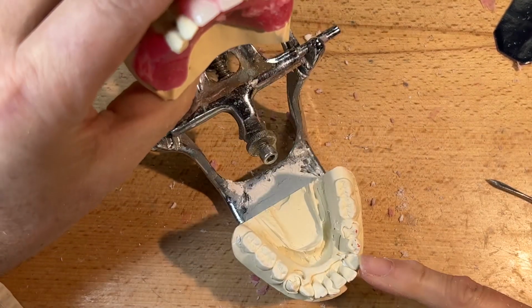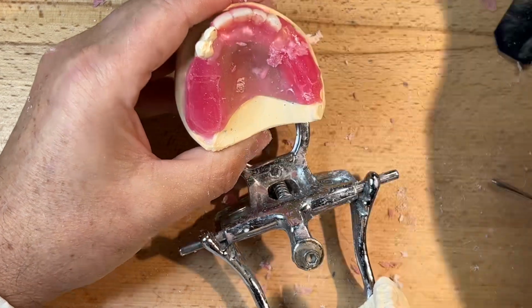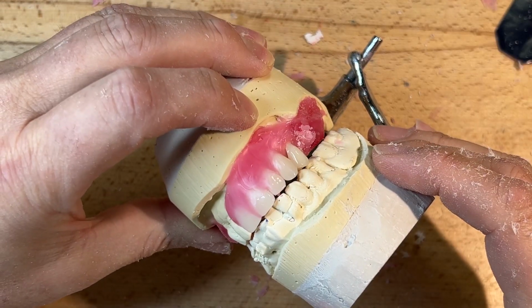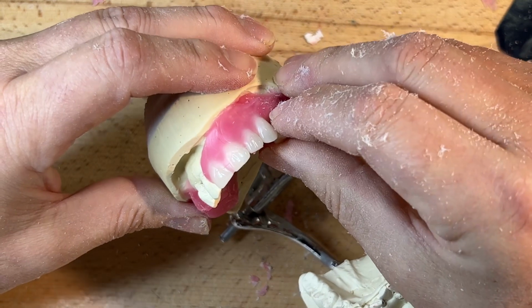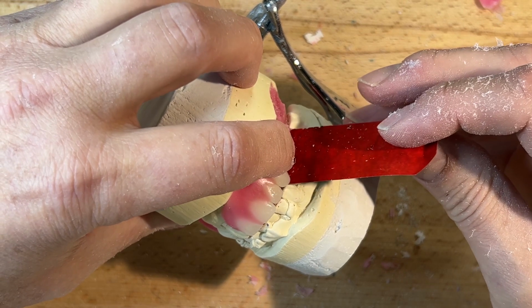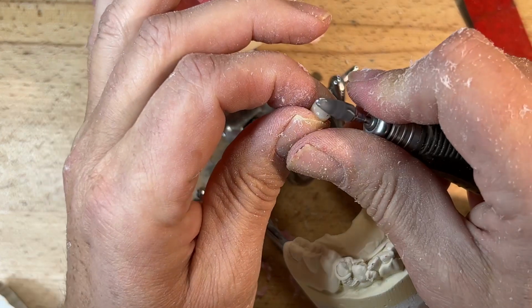Make sure you don't have any bubbles or voids on your opposing dentition. And now let's see if this has maximized its location. There you see that movement. I'm going to trim a little bit more. I'm going to hold that maybe about 0.5 millimeter higher until we get some contact, then I'm going to remove that contact.